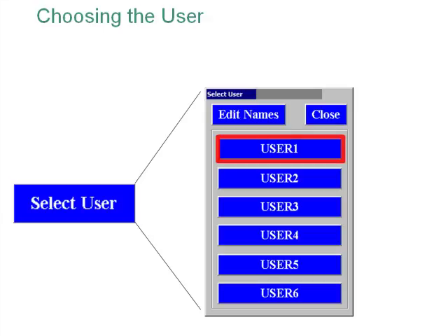The usernames can also be edited by clicking the Edit Names button and typing in a new name for the user.